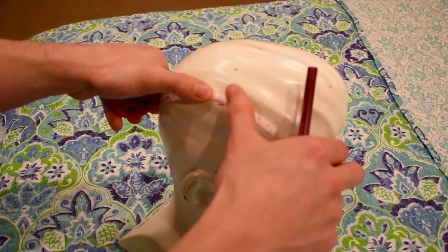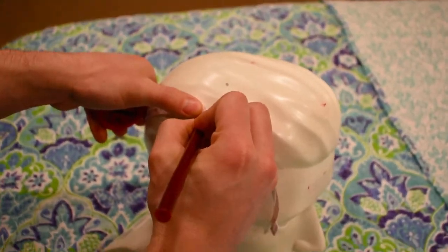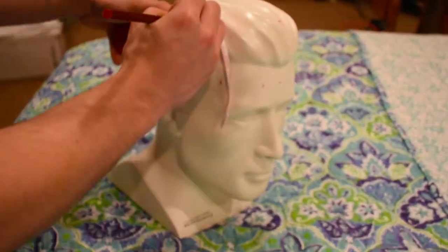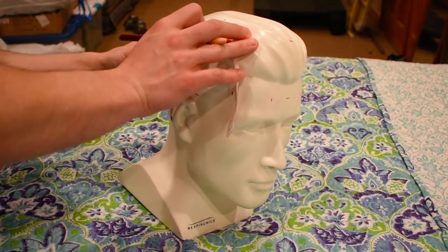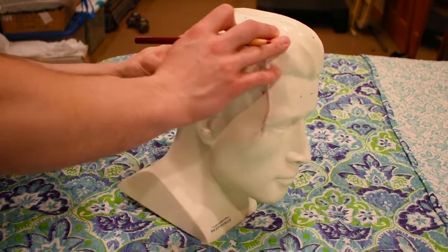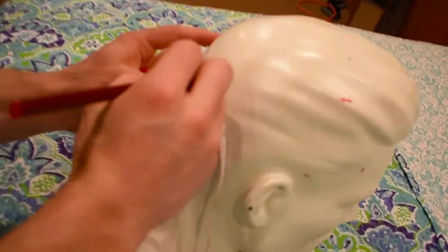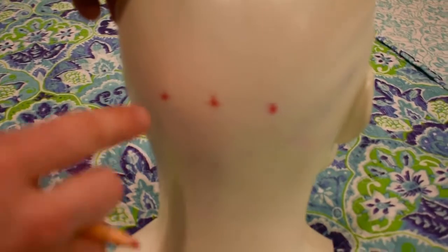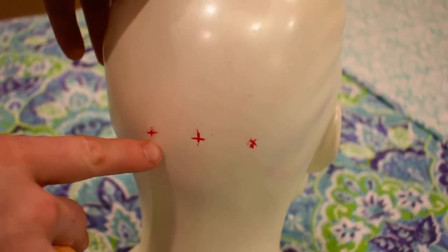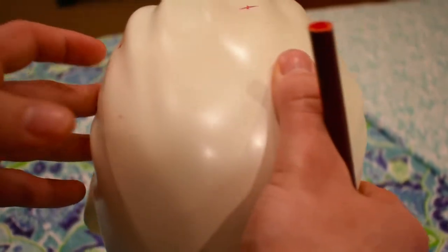It's going to be 13 because it's 26. So that's going to be our marking for C4. And right here we have 26, so we're going to make our marking there. So now we have finished our markings for O1, O2, C4, and C3.